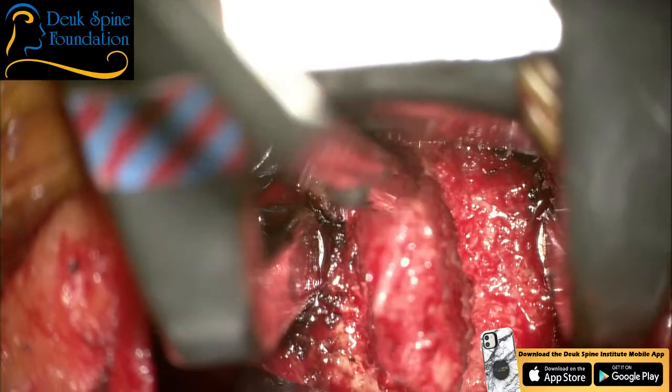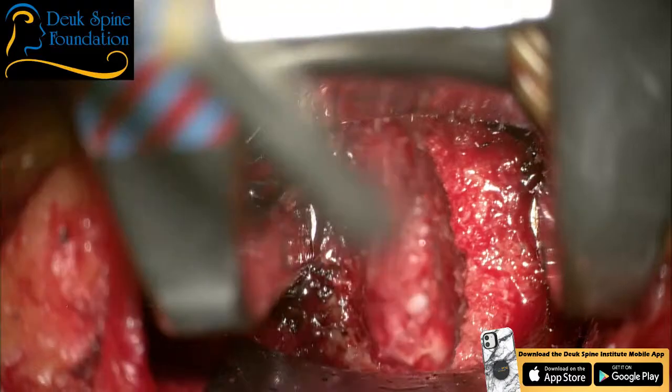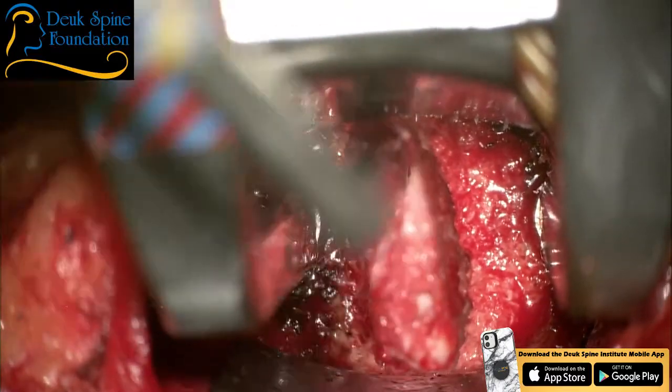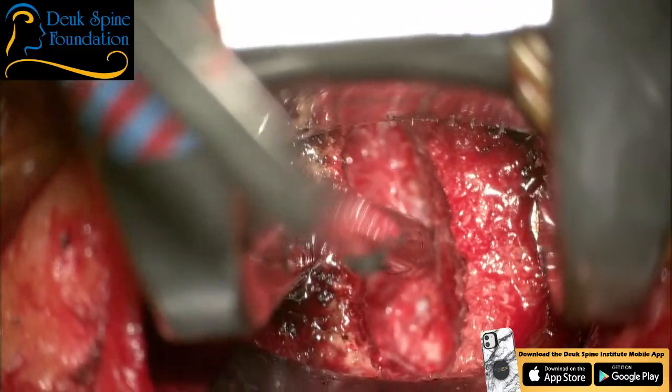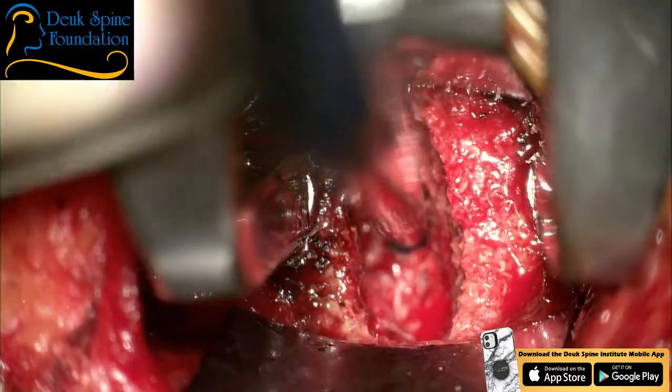What did I have, a 2 or 3 before? No, you had a 4 before. Well, what was I using first when I was working on the disc? 2. Let me see a 3. Yes, sir. The bigger the Kerrison, the better, because you get better bites.